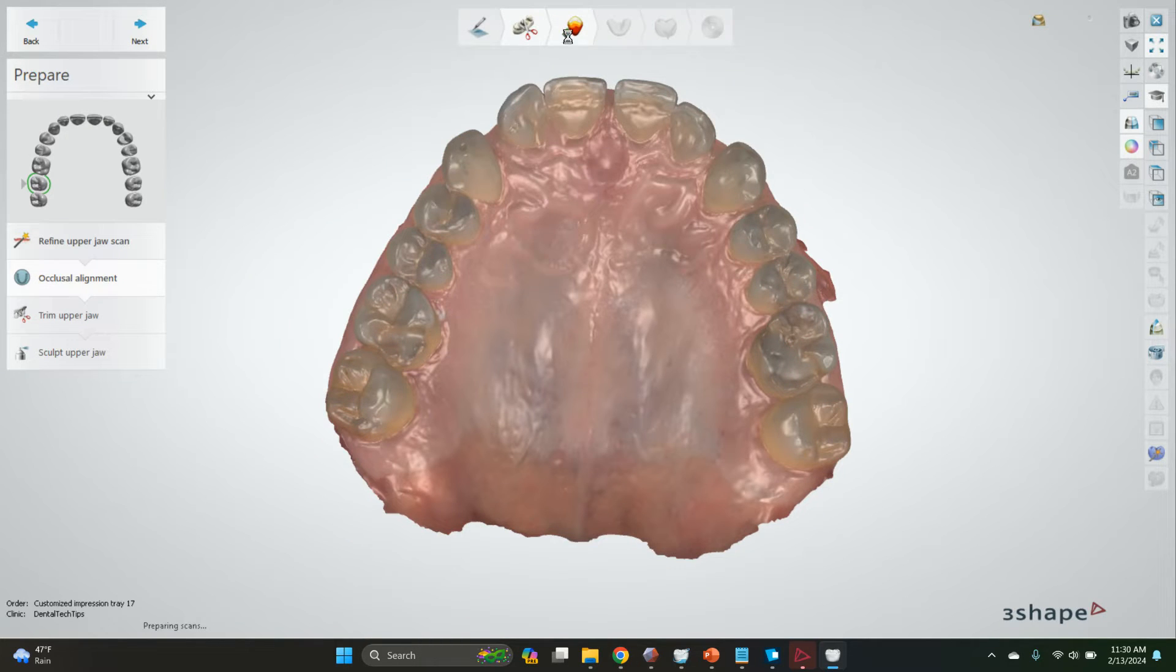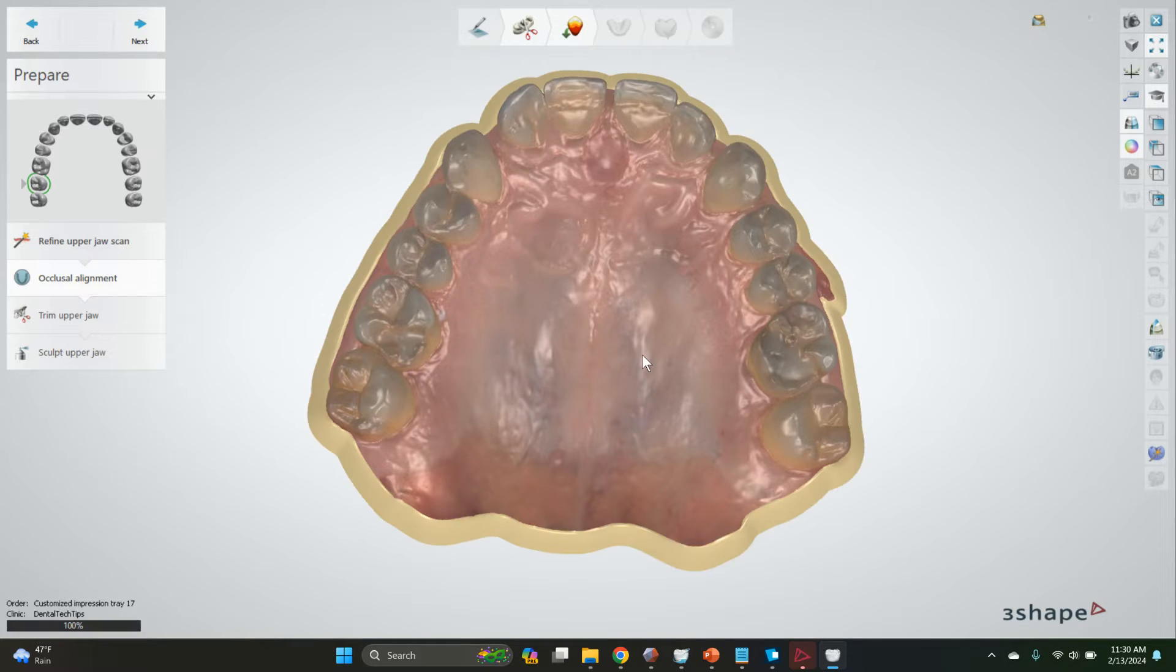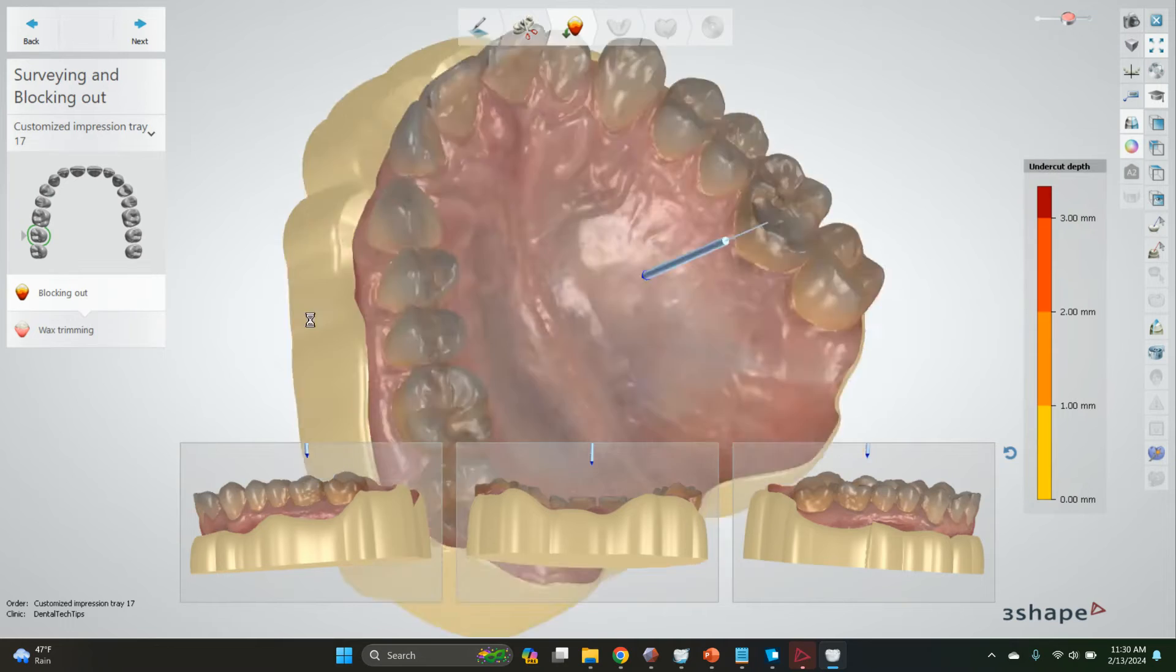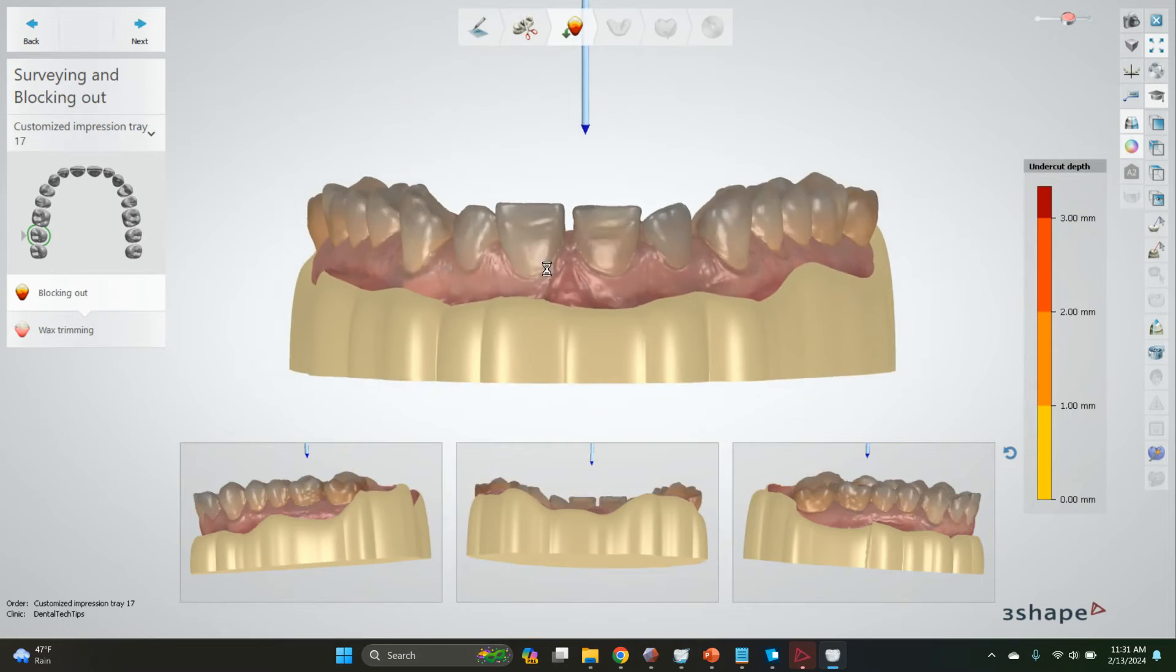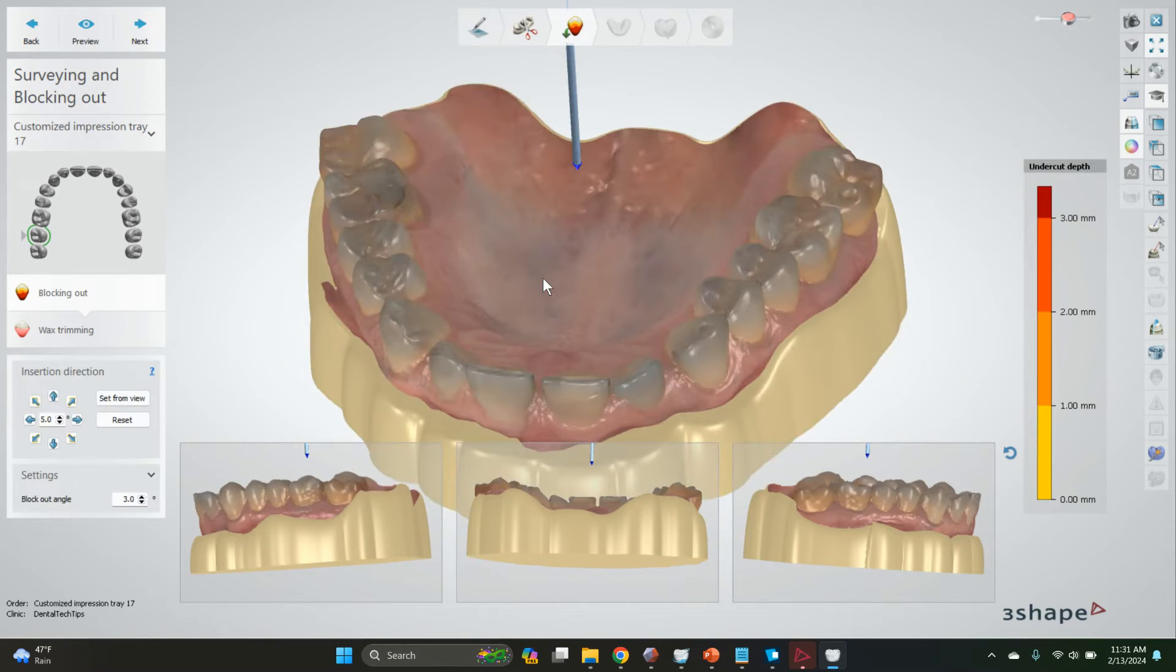Now you get to the insertion direction step here, and then we're going to go ahead to blocking out.